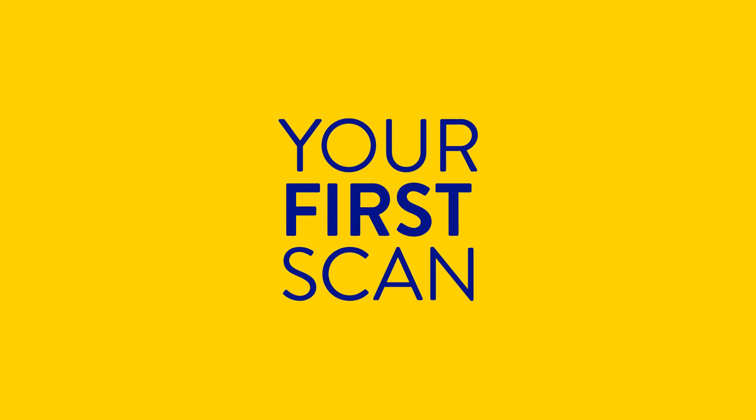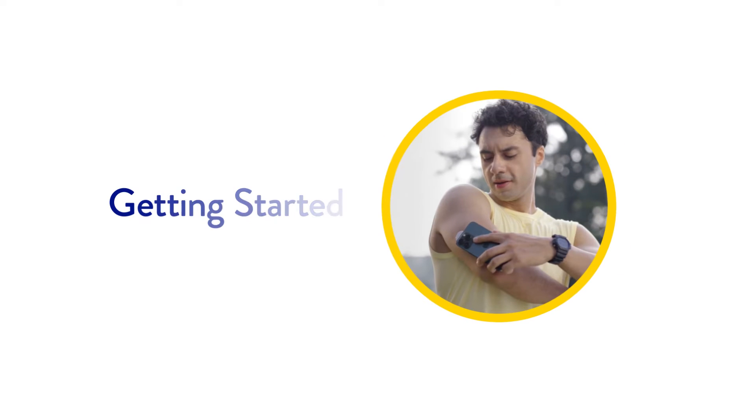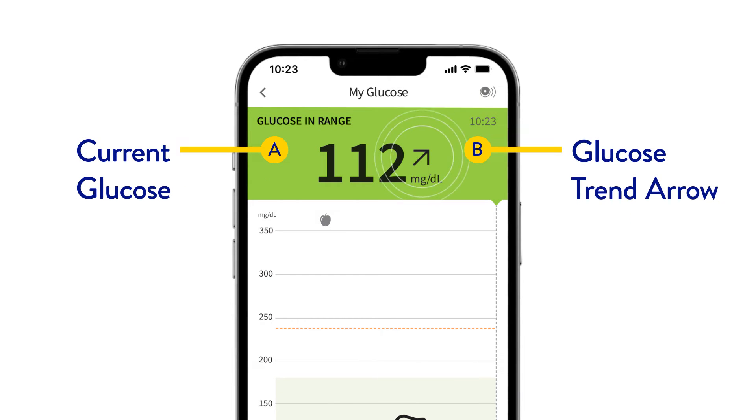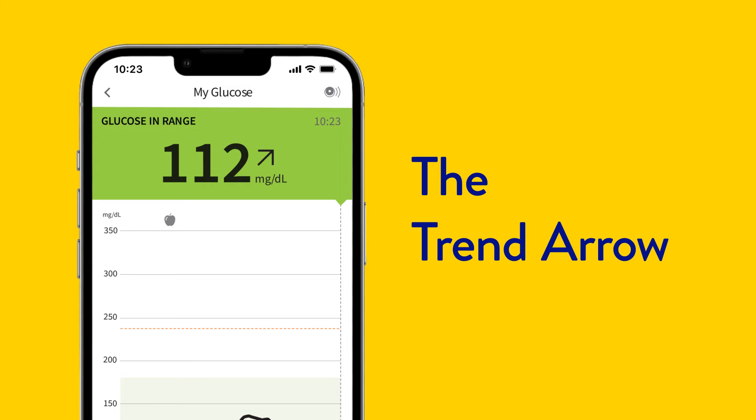Let's talk about what to expect with your first scan. Bring the phone to your sensor to scan it. On your first scan, you'll see your glucose reading and a trend arrow. Your trend arrow shows what direction your glucose levels are heading.